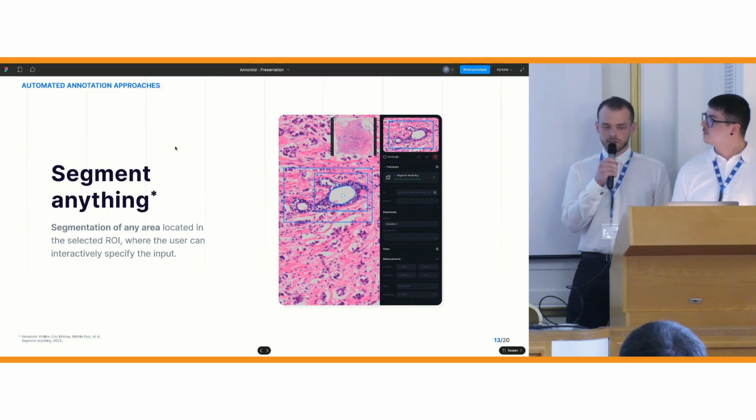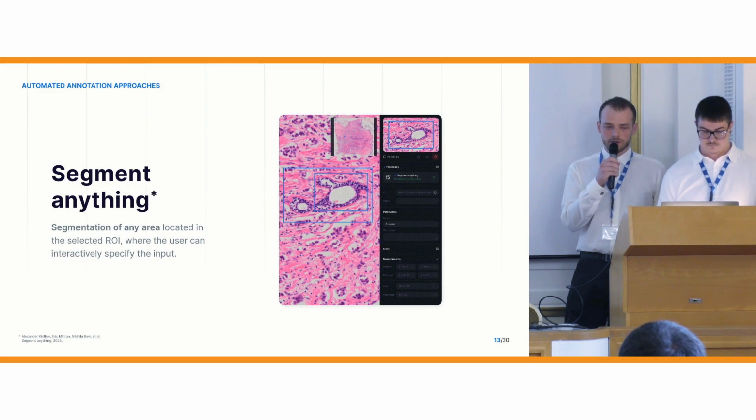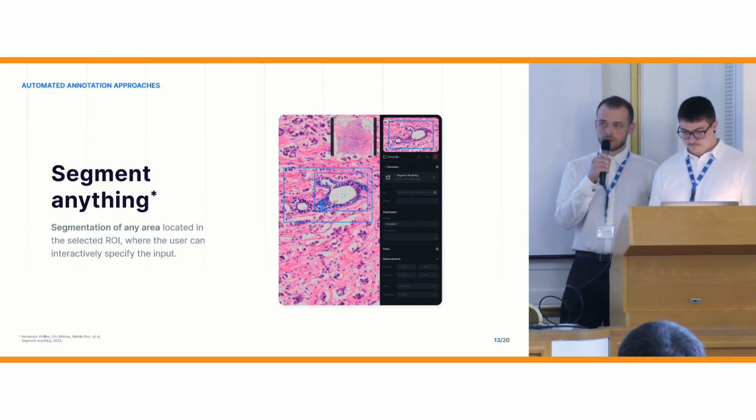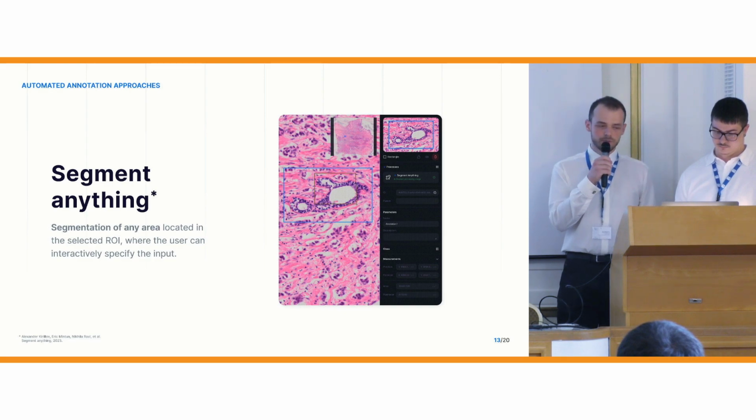SAM is employed in the annotation tool for interactive segmentation of higher structures. This model facilitates segmentation using bounding boxes, foreground, and background clicks. The model weights are obtained from the Segment Anything GitHub repository. The predicted segmentation mask is subsequently adjusted using various post-processing techniques identical to the NuClick model.